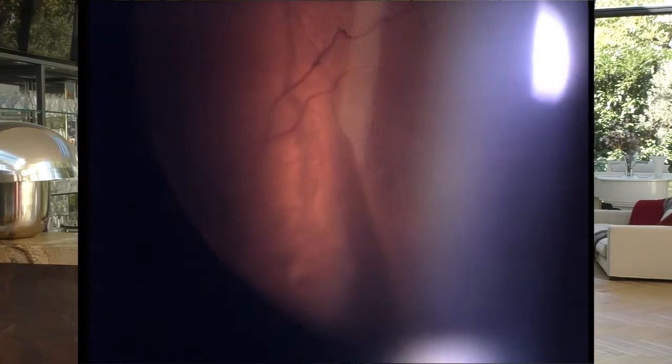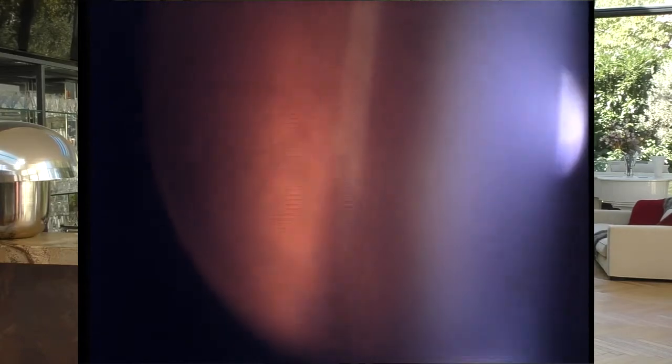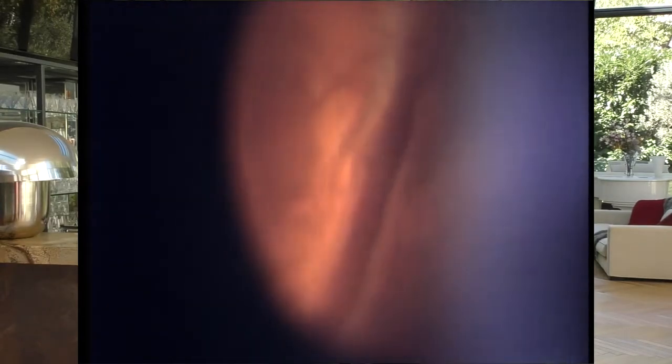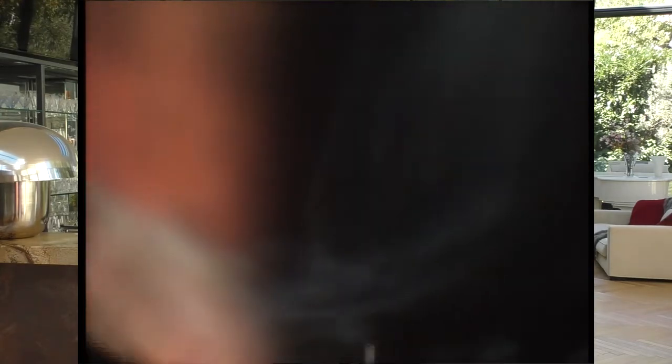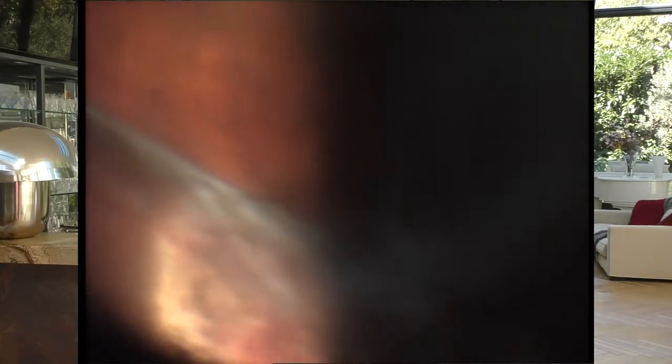An indentation releases the traction, but if done properly, it also releases the base of the vitreous, which becomes essential if there is a small circumferential retinal fold. The vitrectomy, if it is to have a comparable role, must be infinitely complete, because releasing the vitreous base by vitrectomy is not simply done.